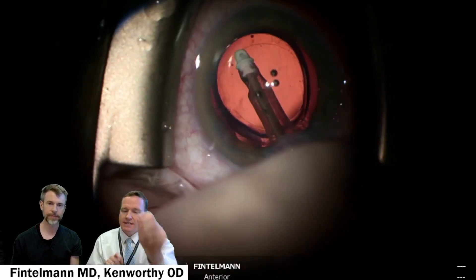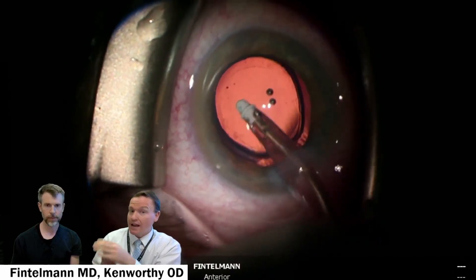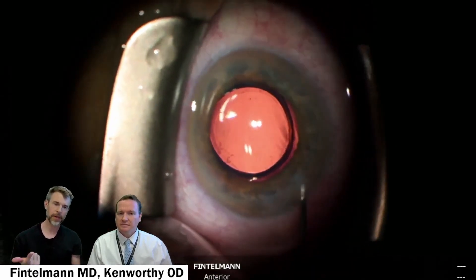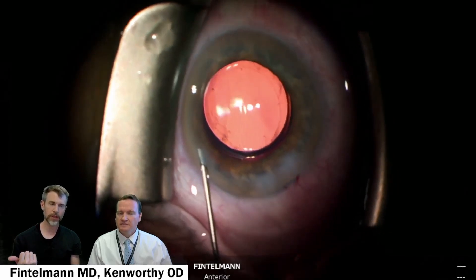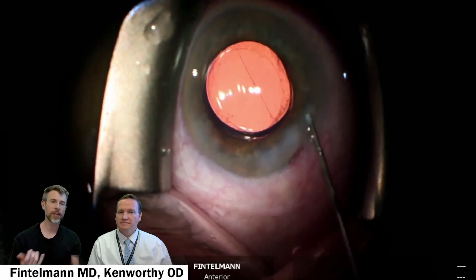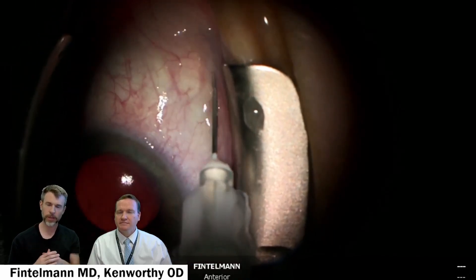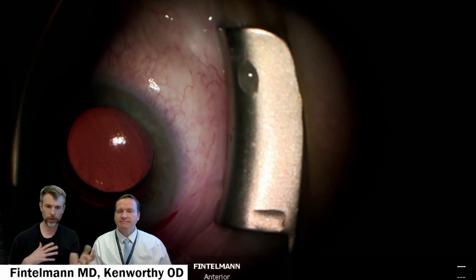How selective can you be in the selection of an IOL? There's material, and of course there's IOL power for the correction of the eye. In terms of brands — Zeiss, Alcon, BNL, among others. The most commonly used materials are hydrophilic acrylic, hydrophobic acrylic, and silicone; PMMA is less used. Then the lens design: what the optics are like, what the power is — which comes usually in half-diopter steps, with only one company doing quarter-diopter. And what the optic is designed to do: multifocal, monofocal, or toric — we'll discuss that another time.